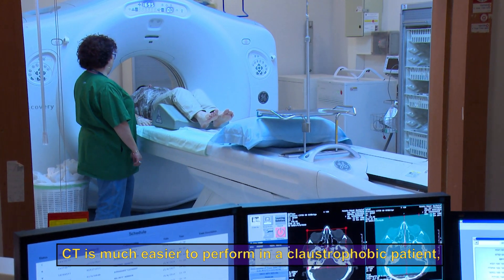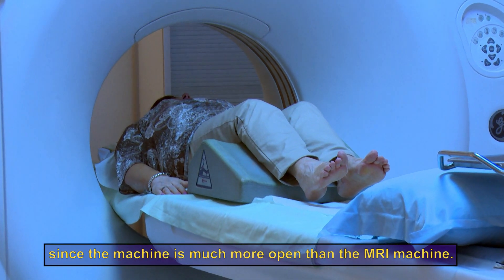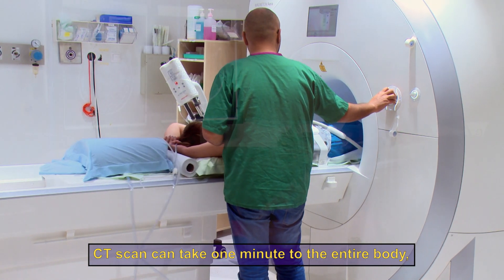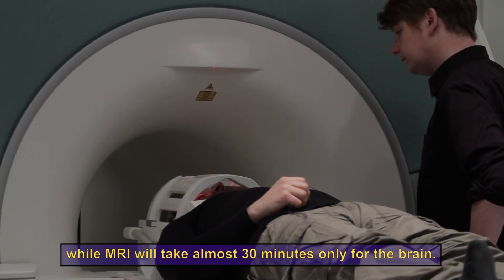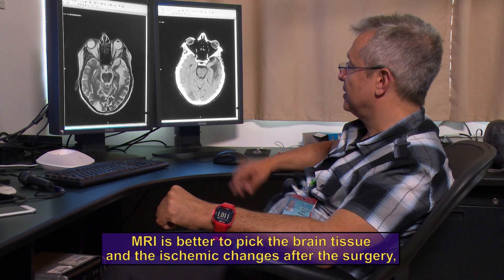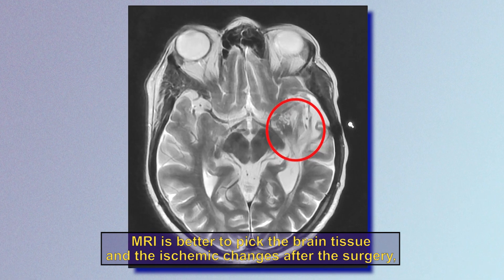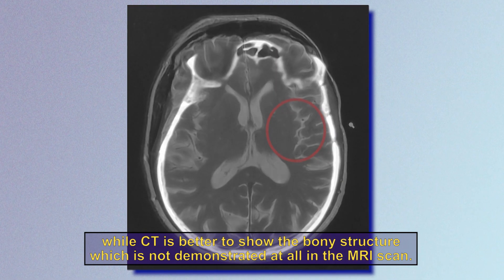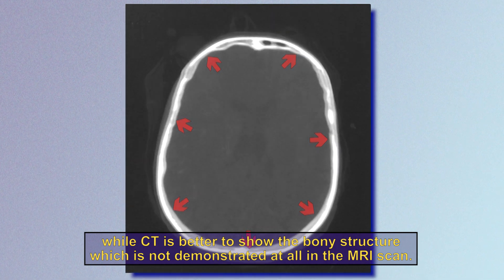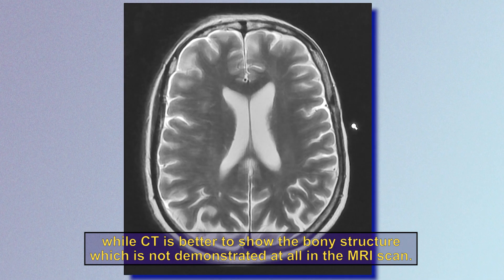CT is much easier to perform in a claustrophobic patient since the machine is more open than an MRI machine. A CT scan can take one minute for the entire body while MRI takes almost 30 minutes just for the brain. MRI is better for picking up brain tissue and ischemic changes after surgery, while CT is better for showing bony structure, which is not demonstrated at all on MRI.